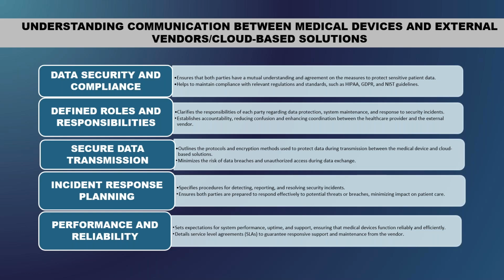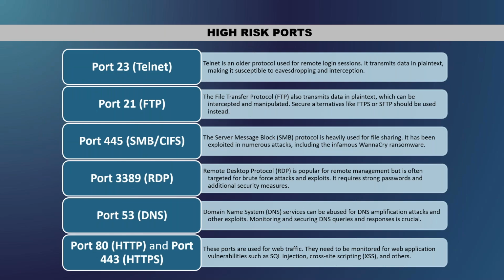So you need to understand how they're securing your data transmission, defining the roles and responsibilities, understanding the compliance, and then their incident response if there's an issue or breach. And then their performance and reliability: what's their performance, and what they need to use the system for. Next slide. Okay, and then we start going over the ports and protocols.